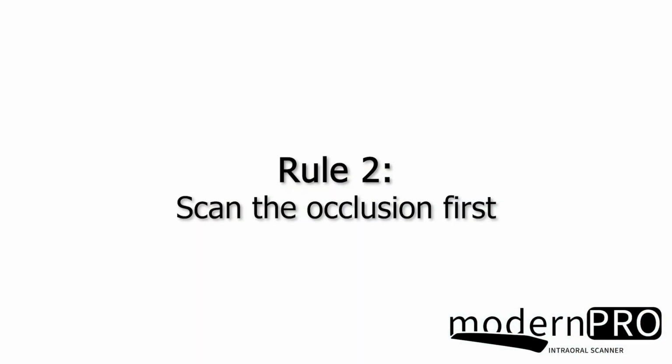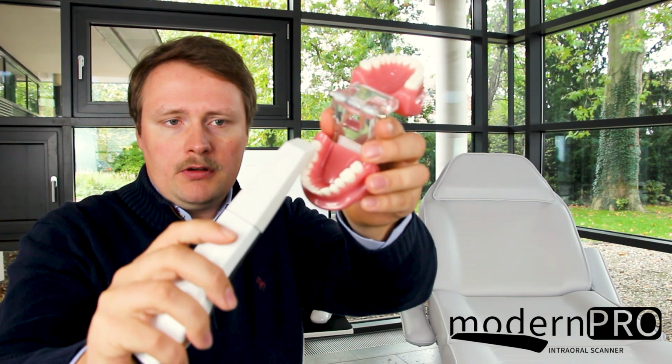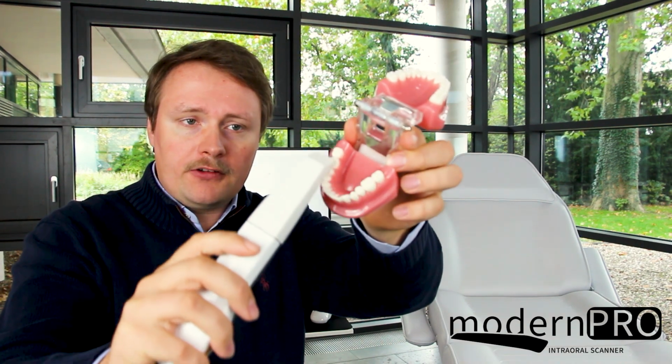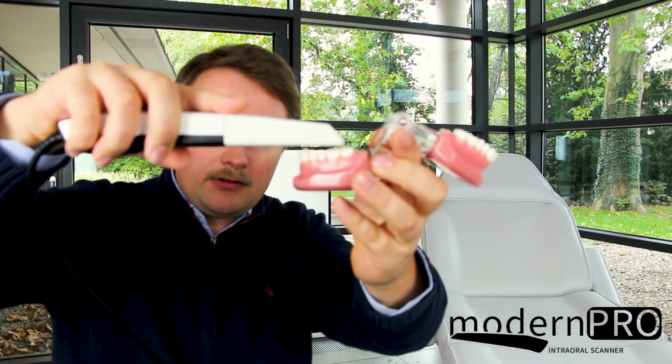Second, when you scan, first thing, try to scan the whole bow on the surface of the teeth. So you put the scanner at half a centimeter distance, you scan the whole bow. This way, the software knows how big the model is in total.